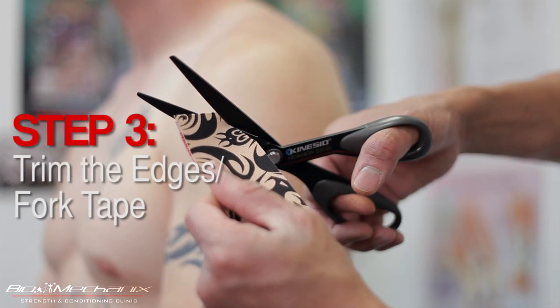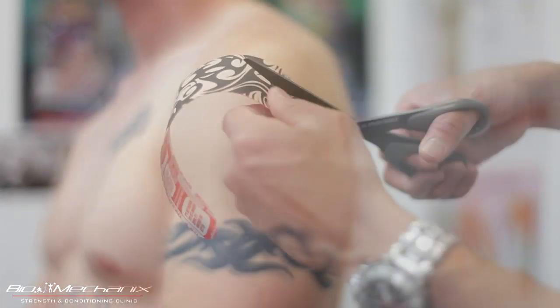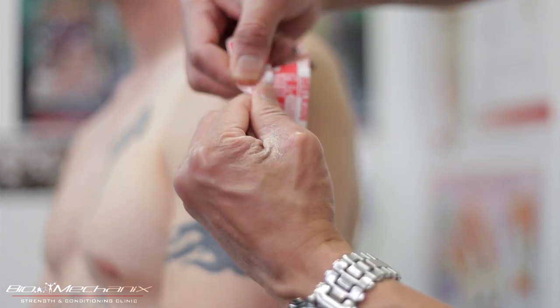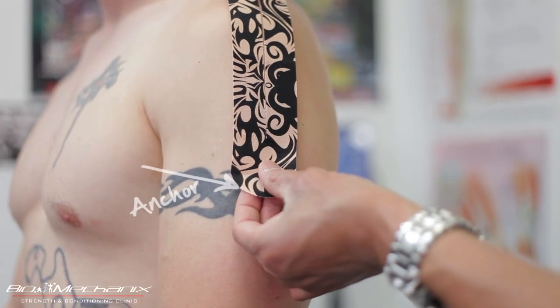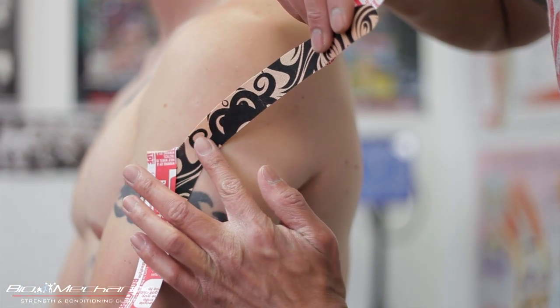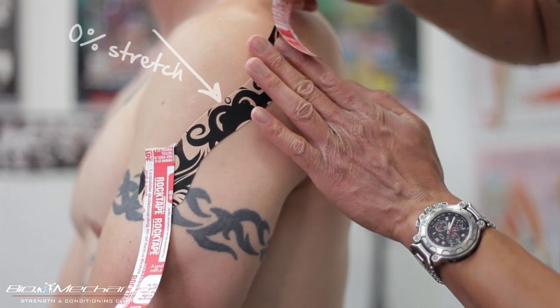I'm going to trim the edges of the tape and for this particular taping I'm going to cut a slit down it to give it a fork type pattern. I'll anchor the tape just below the middle head of the deltoid, then bring the two forks — one posterior to the shoulder and one anterior to the shoulder — with little to no stretch.